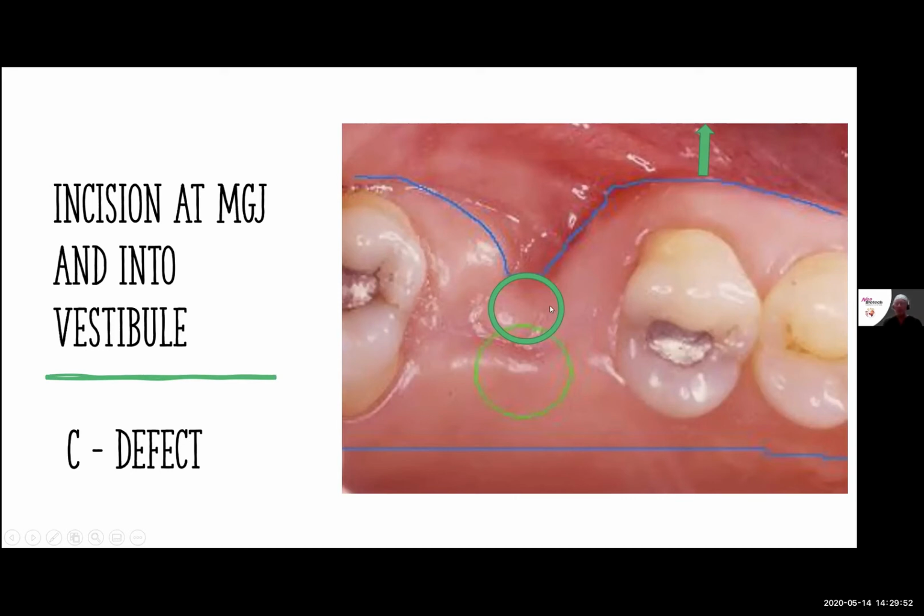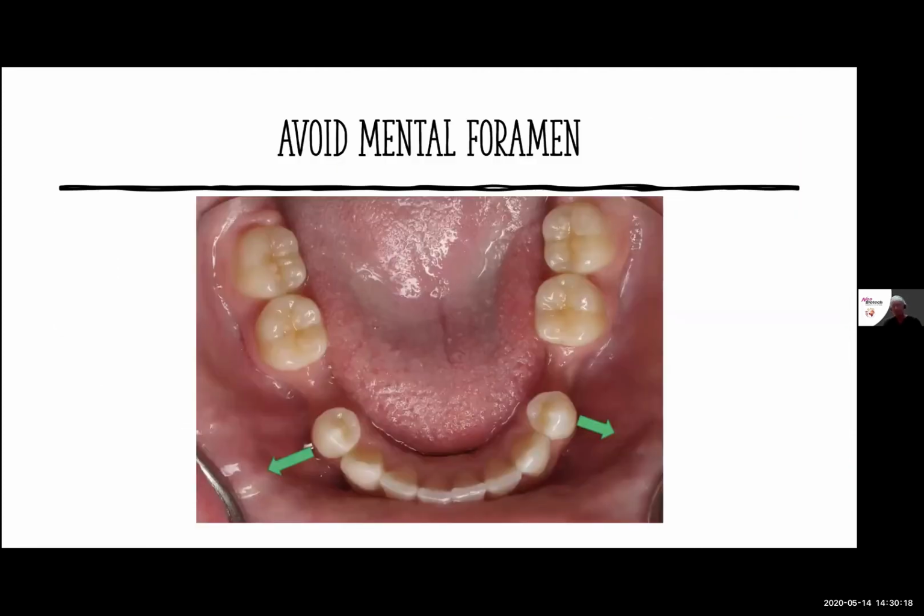And by doing that, that's going to allow us to have our implant. If we were considering placing it here, which would be the appropriate site if we did not have a bone graft, and placing it in the lingual root area, we're now going to be able to move our implant to the proper place and center it where it should be, because we now have bone that's going to grow out to the extent that we need it to grow. And we can do multiple sites at a time.